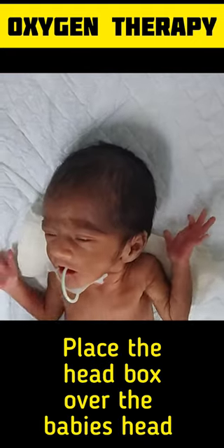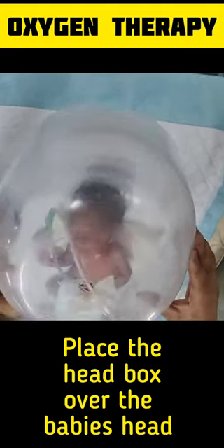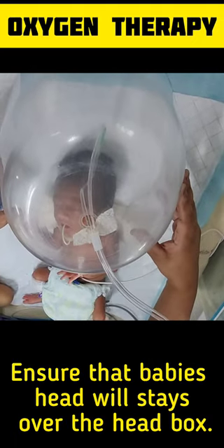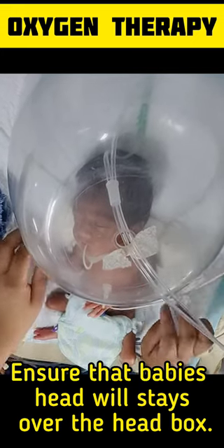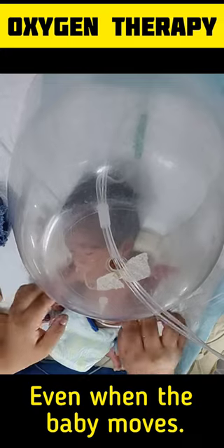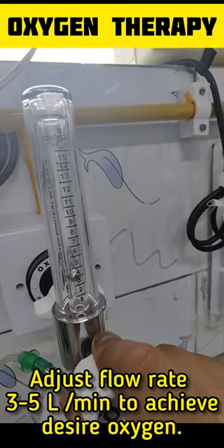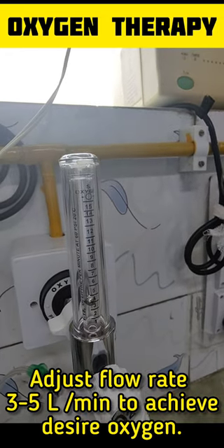First, place the head box over the baby's head. Ensure that the baby's head stays within the head box, even when the baby moves. Then adjust the flow rate of oxygen to 3 to 5 liters per minute to achieve the desired oxygen saturation.